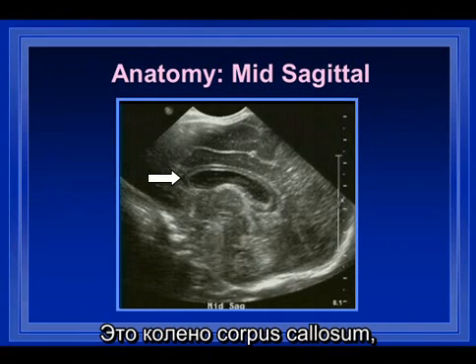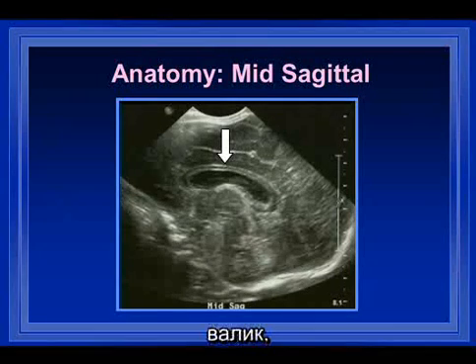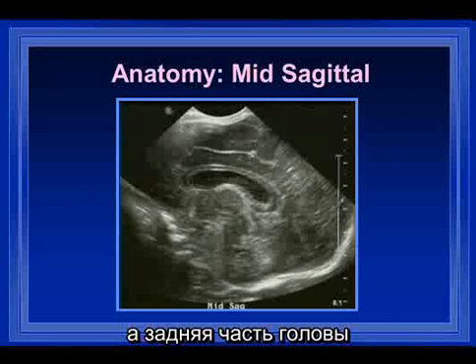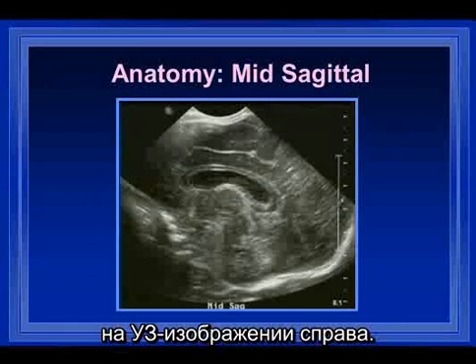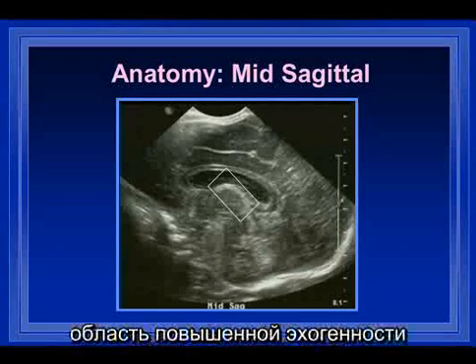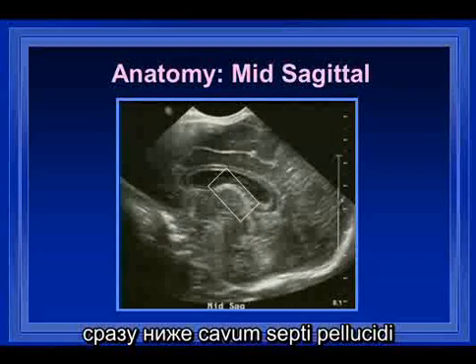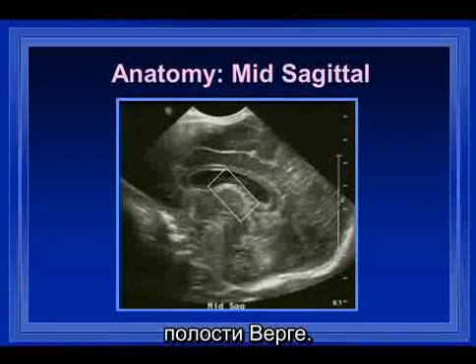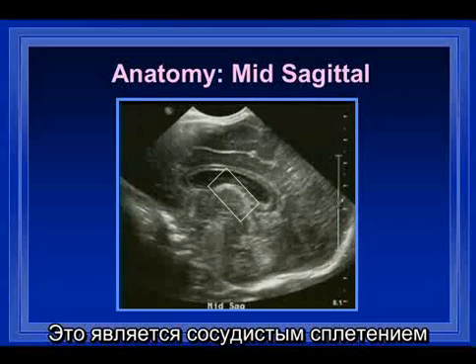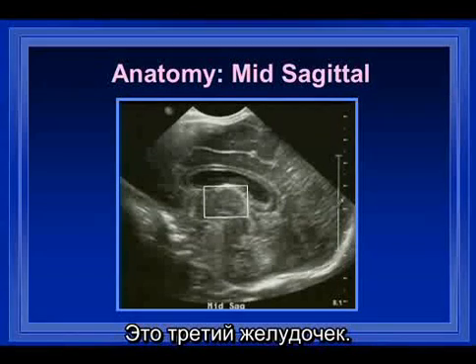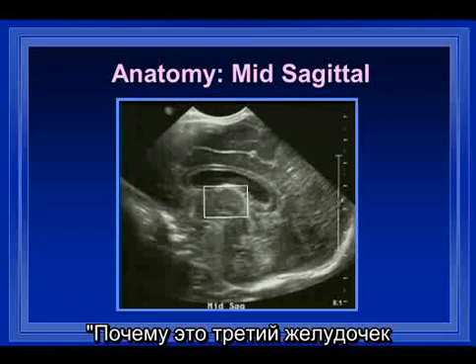Here we have the genu, the body, and the splenium of the corpus callosum, and here we see the ultrasound image of this anatomy. This is the genu of the corpus callosum, the body, the splenium, with the baby's head facing to our left and the posterior aspect of the baby's head to our right. This is the cingulate gyrus, and here we can see bright echogenicity right below the cavum septum pellucidum and the posterior extension, the cavum vergae.